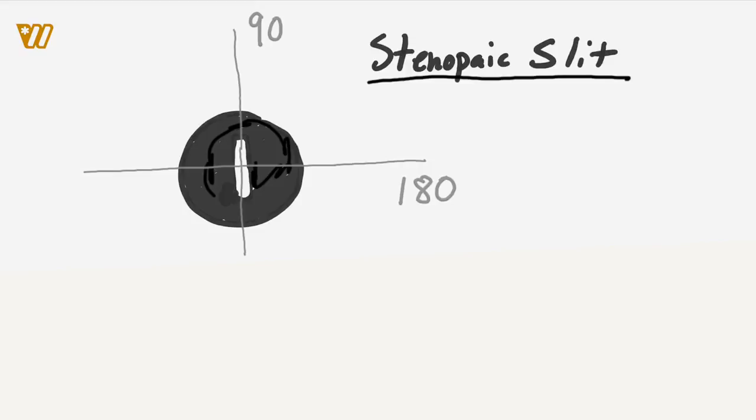To neutralize the patient, while you have this slit vertical, you're going to put spherical lenses, either plus lenses or minus lenses, in front of their eye until they say, hey, that makes the world the clearest. Whenever you do that, that's going to be the power you put on the vertical aspect of your power cross. Then you rotate your slit 90 degrees and do the same thing for the horizontal aspect of your power cross. So that's going to be one key point.